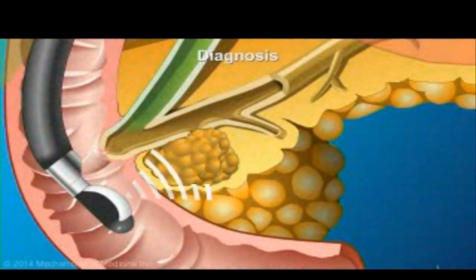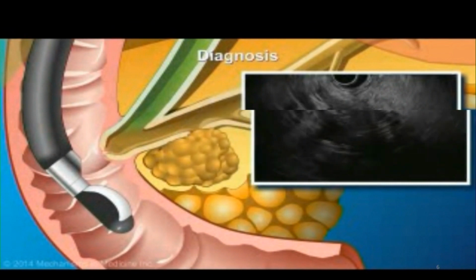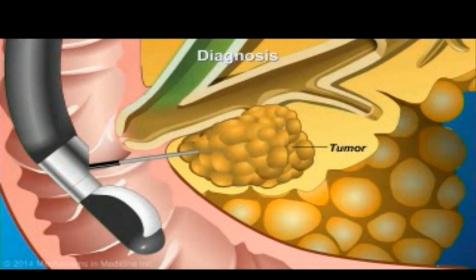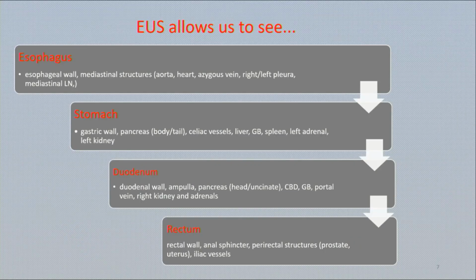The most important organ which you can see with it is the pancreas, which is lying behind the intestine. It is lying between the spine and the abdomen, so it's not a very easy area to take a sample or biopsy from, but as you can see, you can put a needle through this and take a sample from there. So what indications do we use EUS for?